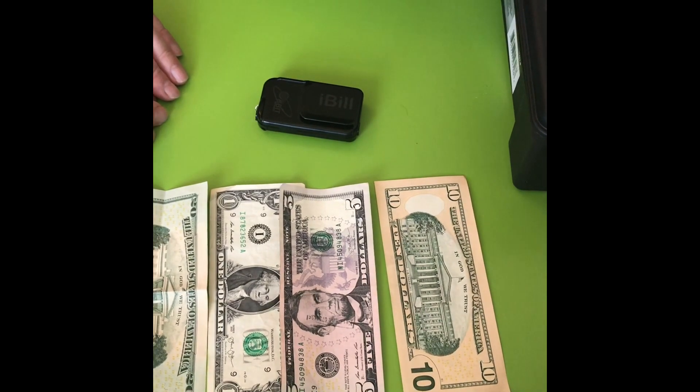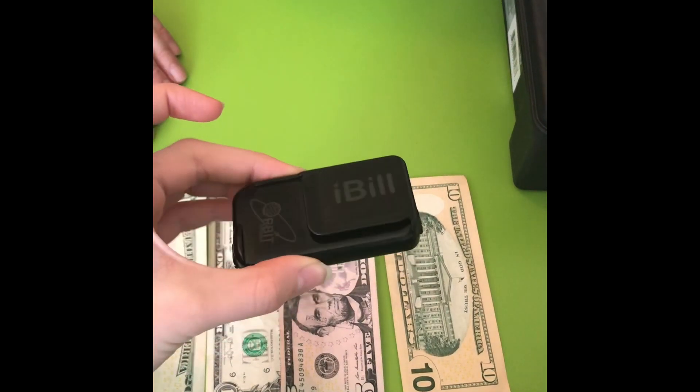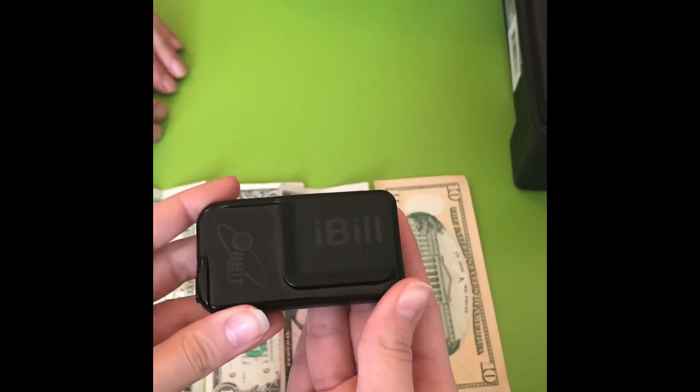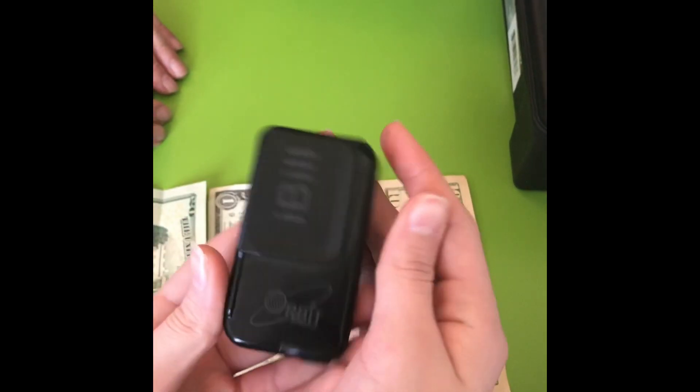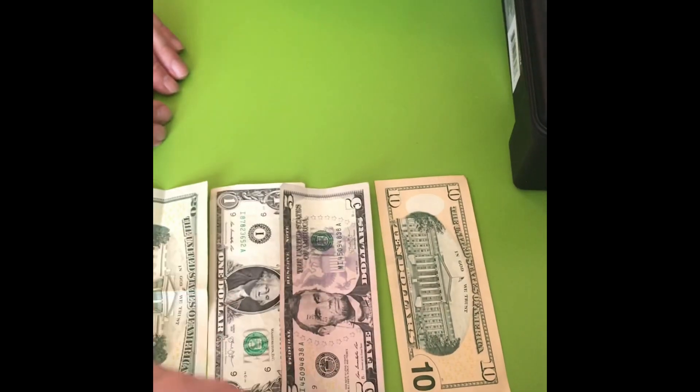One is a device called the iBill, which is free of charge for all visually impaired people, and it comes from the National Library Service. The other thing I'm going to show you is an app, which I'm currently running on the iPad, but normally I use it on the phone when I'm out and about.